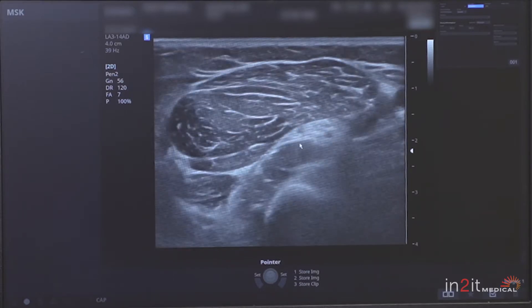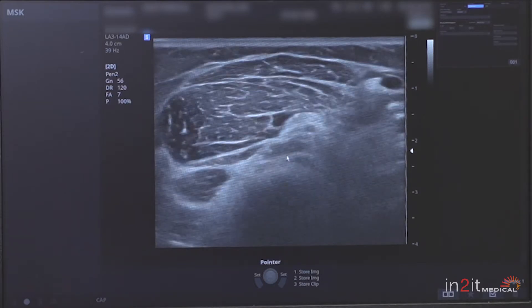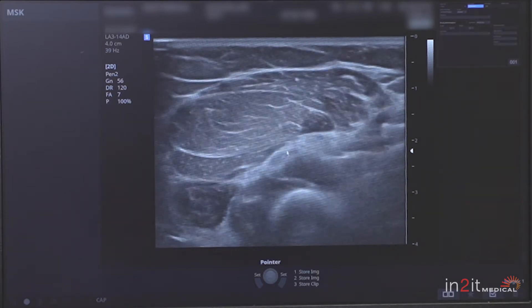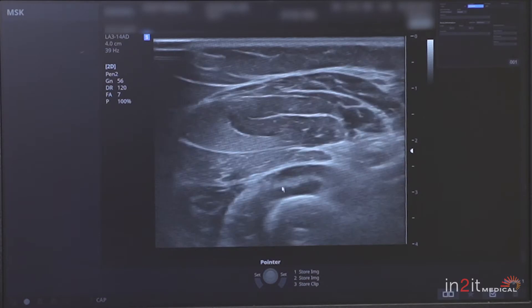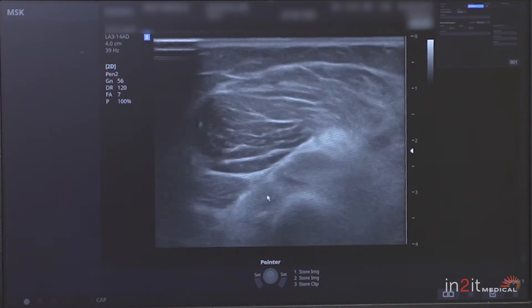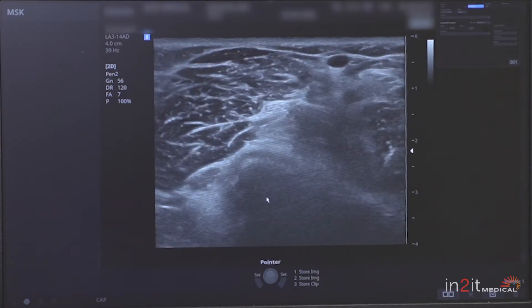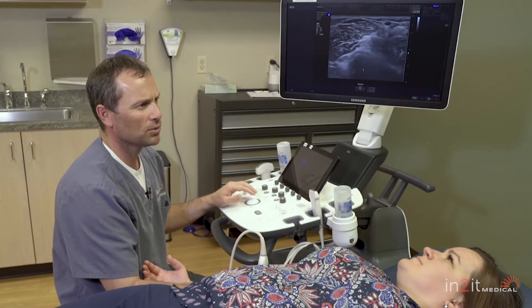The deep branch of the radial nerve oftentimes gets entrapped in this part of the elbow called the arcade of Frohse, and it goes through this muscle called the supinator. You can see I can track that nerve right through the supinator into the back of the arm. This utility goes on and on — I can see it in the axilla, in the knees, in the ankles, wherever it may be.